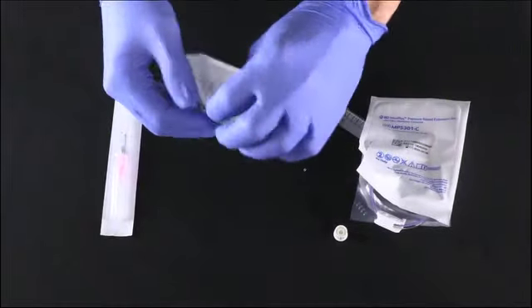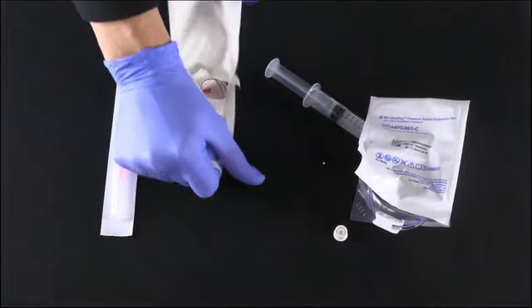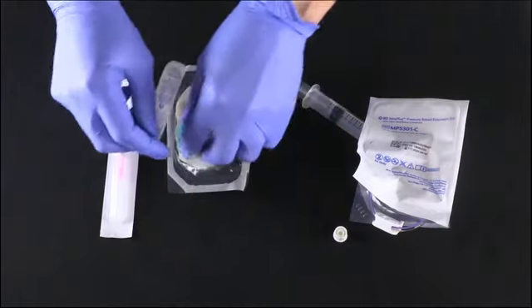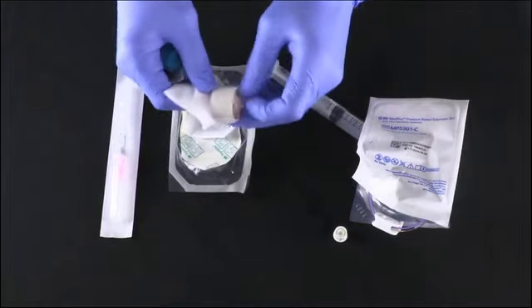The next thing you want to do is open up that IV kit. The reason you want to do this is because you want to make sure that you have everything ready to go. And you also want to make sure that it includes everything. That's your ChloraPrep. That's the bullet version. Then you have the tourniquet. Then there's the micropore tape and gauze.